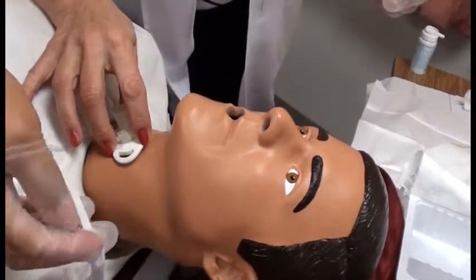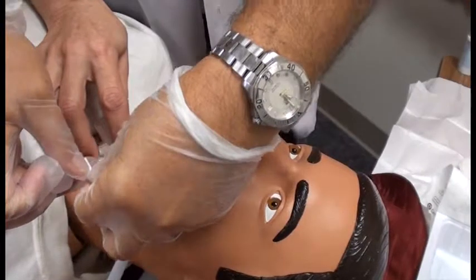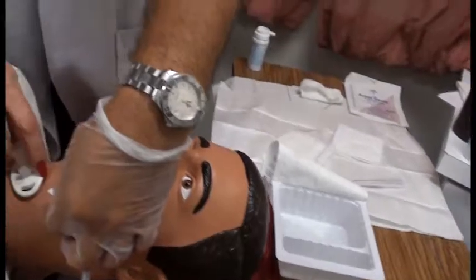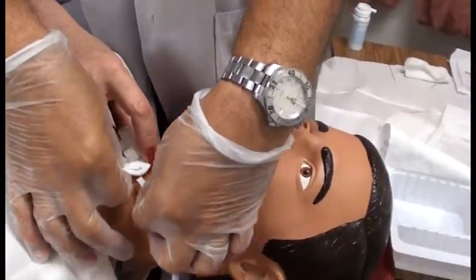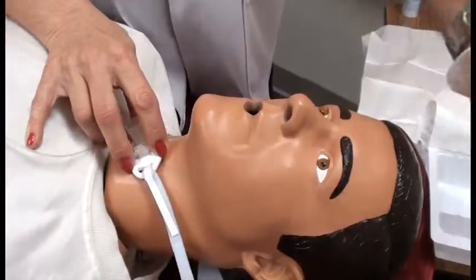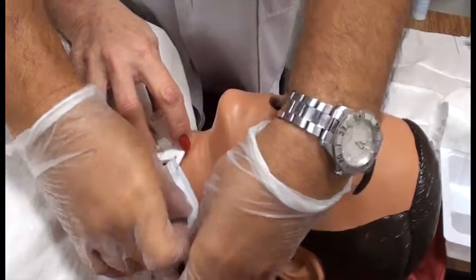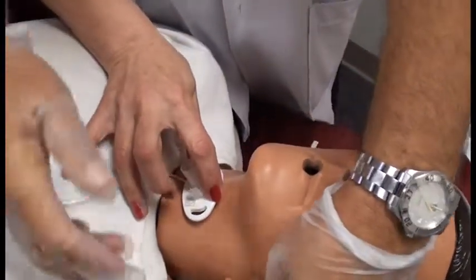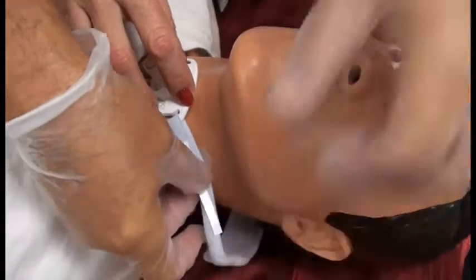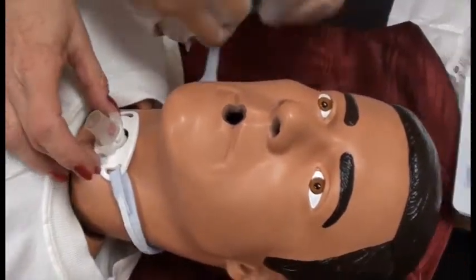Now we're going to put the new trach tie, and it's going to go right inside the eyelet here. And if I can demonstrate, I'm going to move my middle finger out of the way. Okay, and insert this like so. Let me demonstrate that again. For those of you who didn't see, lift up the middle finger here, get it out of the way, and I'm going to insert this trach tie and secure it with the Velcro like so. And then I'm going to do the same thing on the other side.